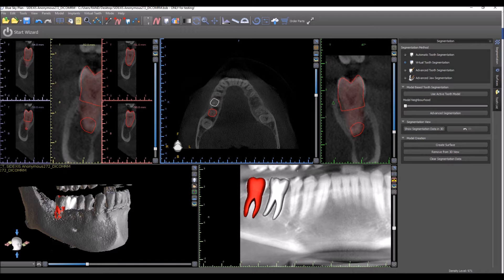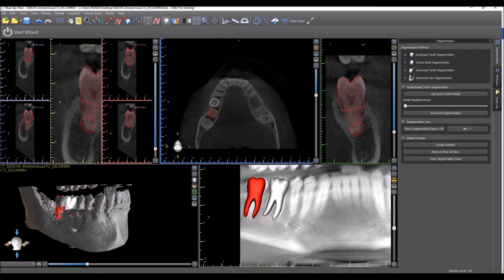What we're going to take a look at now is the virtual tooth segmentation. Virtual tooth segmentation allows us to extract or remove teeth from the 3D view based on virtual teeth that are placed. This could be done for teeth with roots, or it could be done for just the crowns of the teeth without the roots.